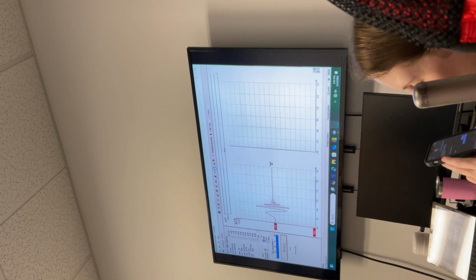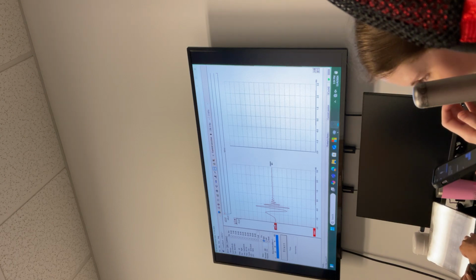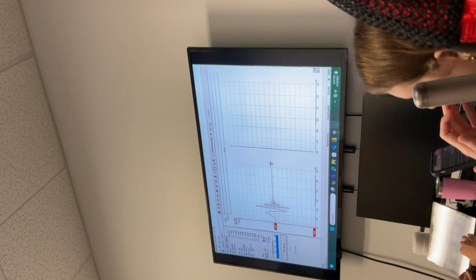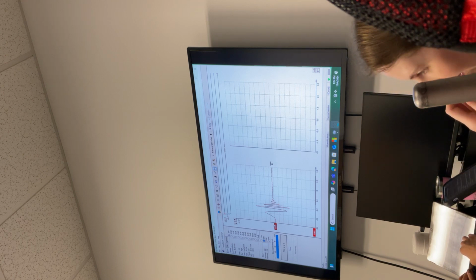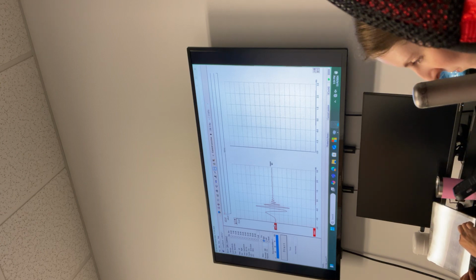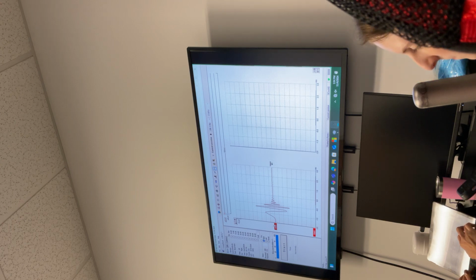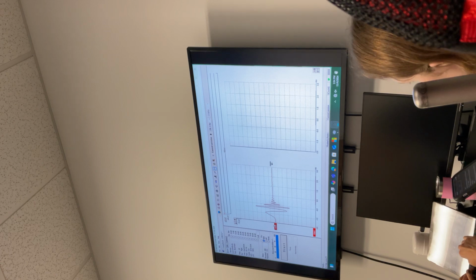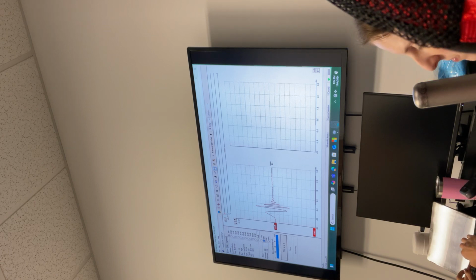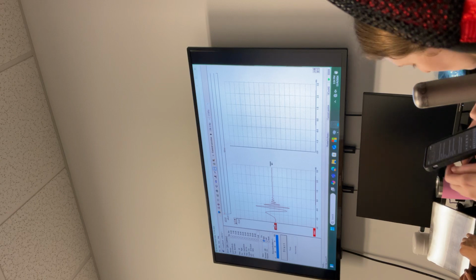It's an engineering decision from the Eclipse system that they've adjusted the 0 point for averaging so that the wave 5 latency for all the chirp family stimuli matches that of the click. This is against the physiological changes, what happens. 500 Hz is longer. But here they've adjusted the 0 point so that it's always the same.